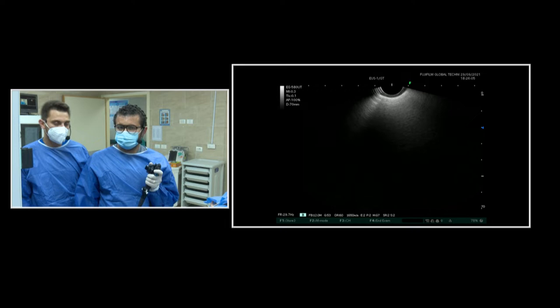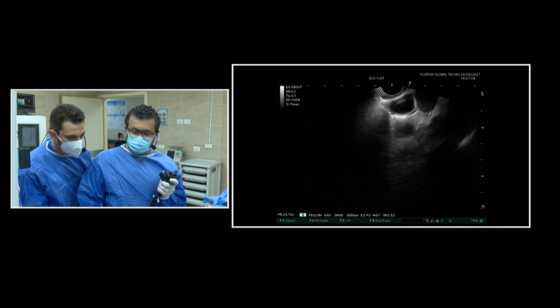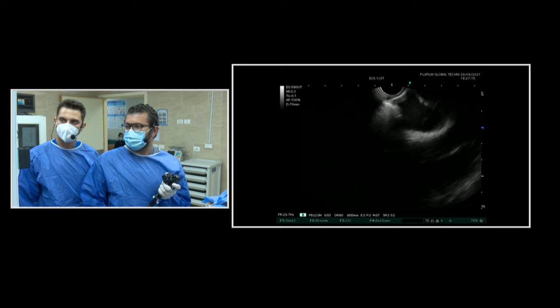Right now, Dr. Yunan, where are we? I think we are about 30 centimeters from the incisor. We started in the mediastinum. Here I wanted to illustrate — here is the heart. I can see it beating. So the atrium and the ventricle — left atrium and left ventricle.